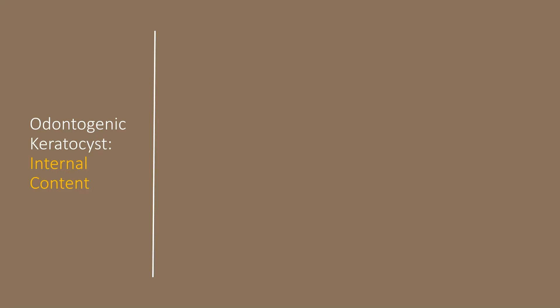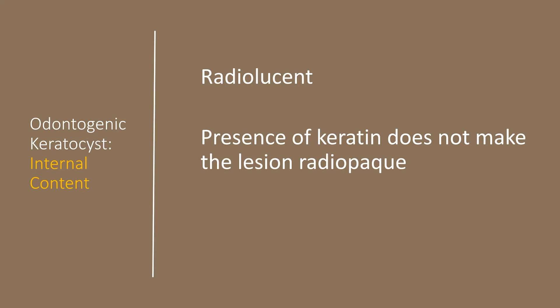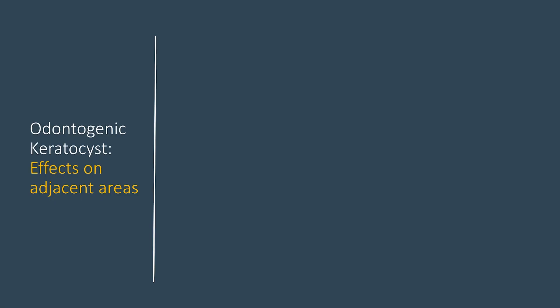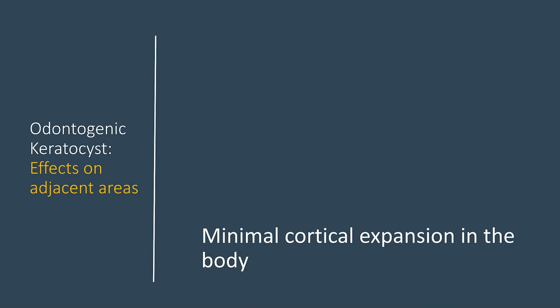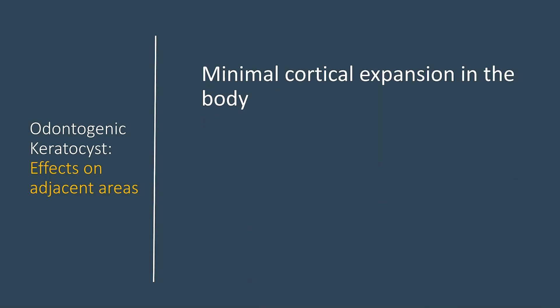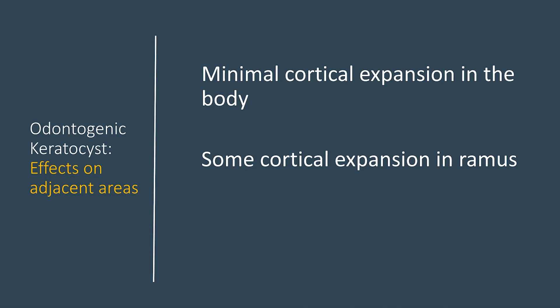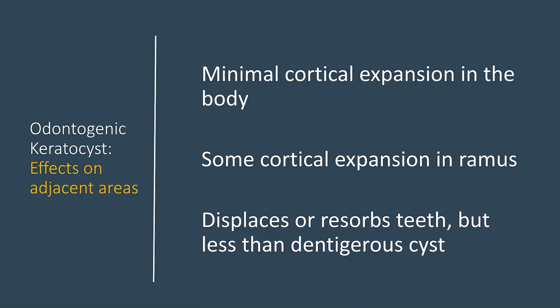The internal content of this lesion is always radiolucent. The presence of keratin does not make this lesion radiopaque. Occasionally, you can see septa inside this lesion, which may give the appearance of an ameloblastoma. Regarding effects on adjacent structures, there is minimal cortical expansion in the body, though there may be some expansion in the ramus. It can displace or resorb a tooth, but this is less common than with a dentigerous cyst. In our case, we saw mild displacement of the molar while there was not much expansion of the cortical plate.